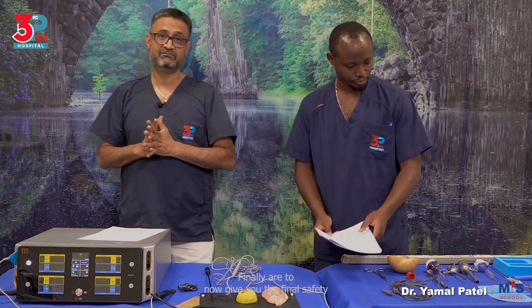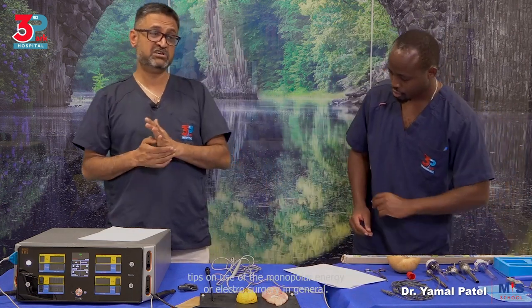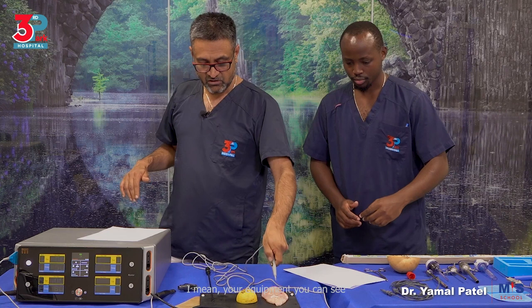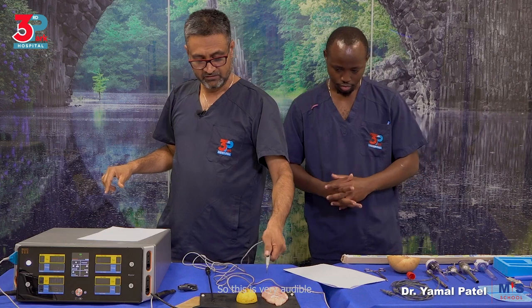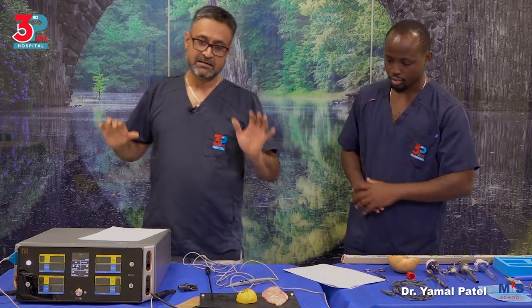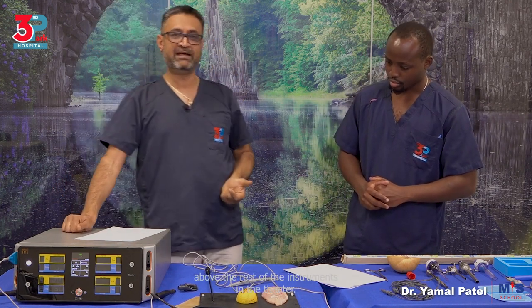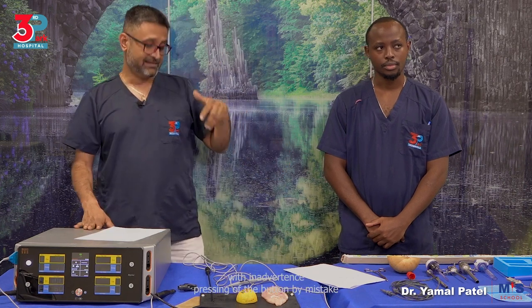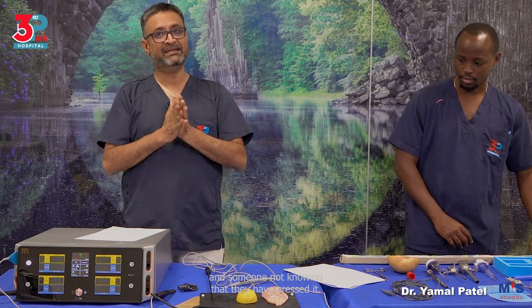Finally, to now give you the final safety tips on use of the monopolar energy or electrosurgery in general: number one, your equipment, you can see, should be very audible. So this is very audible. Make sure that it's audible and set at a level above the rest of the instruments in the theater. If it is set low, then you will have an issue with inadvertent pressing of the button by mistake and someone not knowing that they have pressed it.